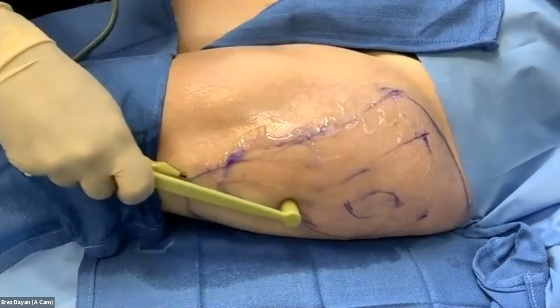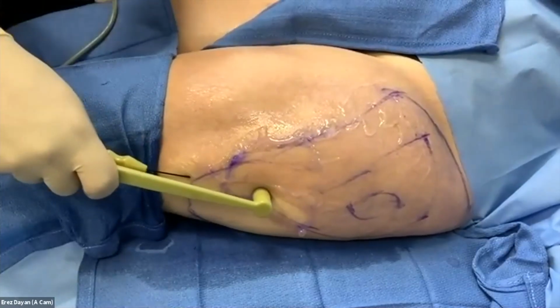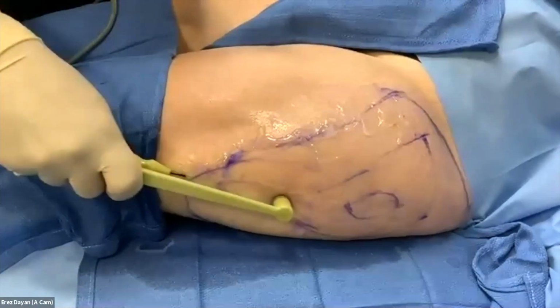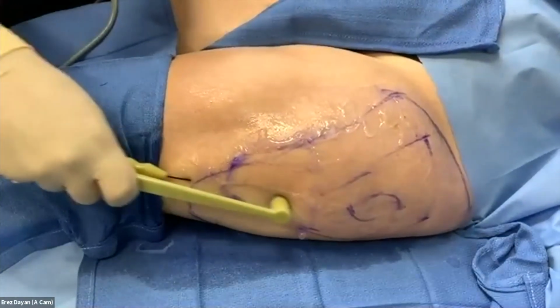But like you just pointed out, if you're not overtreating by staying on there longer, you're just maintaining that temperature. You doing okay there, Sandy? You feeling anything? Fabulous. So she's doing good. She said fabulous. It's like a spa day here.